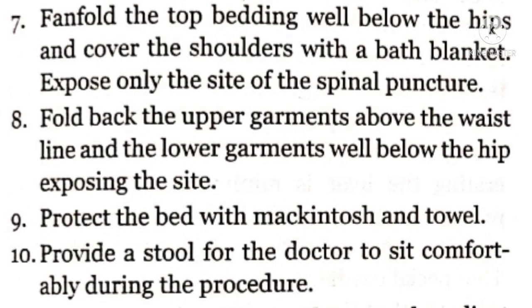7. Fanfold the top bedding well below the hips and cover the shoulders with a bath blanket. Expose only the site of the spinal puncture. 8. Fold back the upper garments above the waistline and the lower garments well below the hip, exposing the site. 9. Protect the bed with mackintosh and towel. 10. Provide a stool for the doctor to sit comfortably during the procedure.